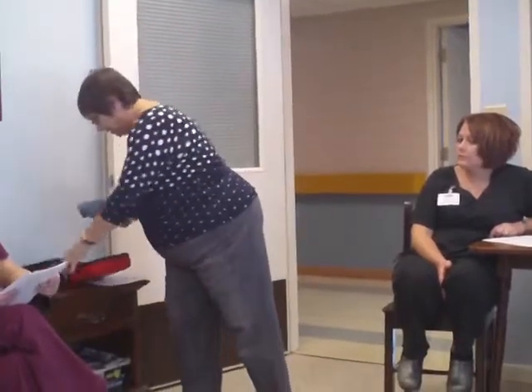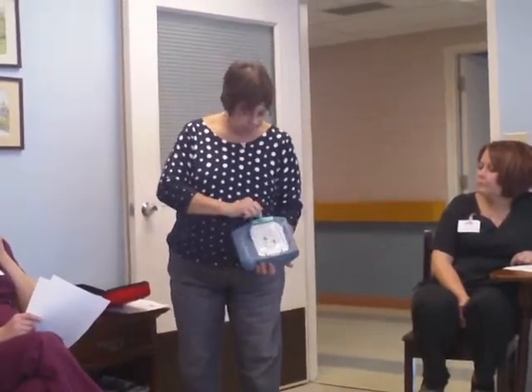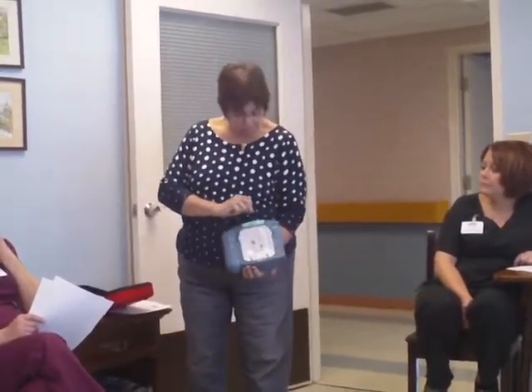Is it the same voice? I'm not going to run it for you because, look how much smaller this little battery is. It's supposed to be good for a lot longer than the other battery, but I'm not going to chance it, because every time we run it, we run the battery down. But it is pretty loud, it's set at the highest setting, which is 8. I haven't been to the website and gotten all the details yet, but it's pretty simple. Denise and I did this earlier. Denise pulled this down, and no bells or whistles, no alarms went off. All good.